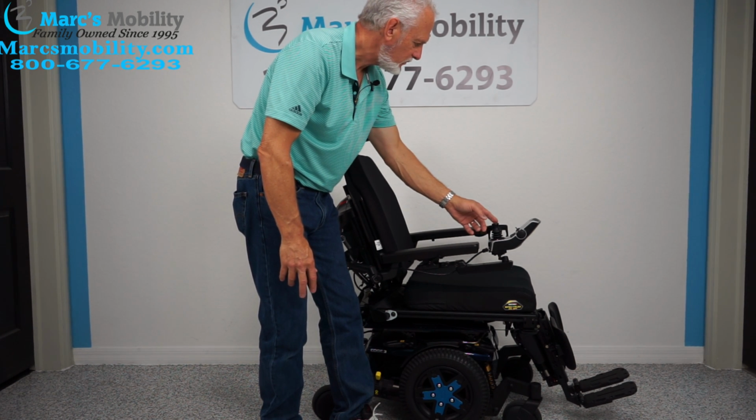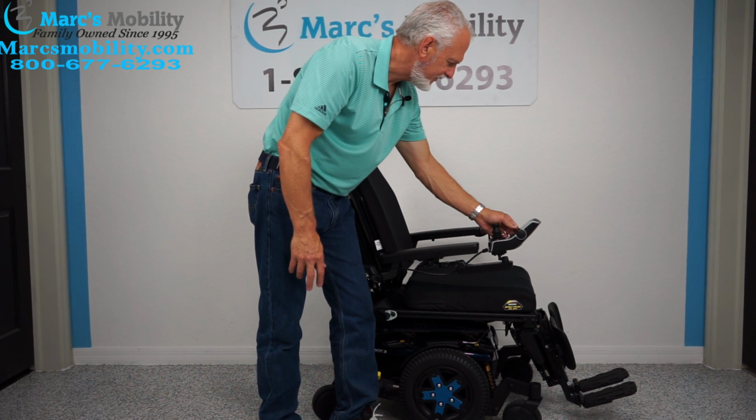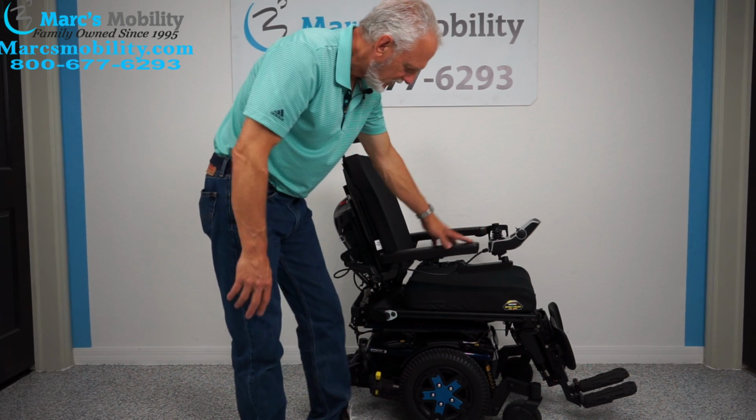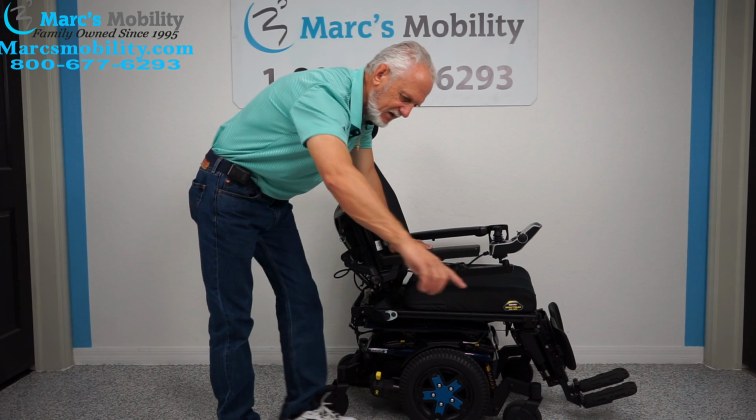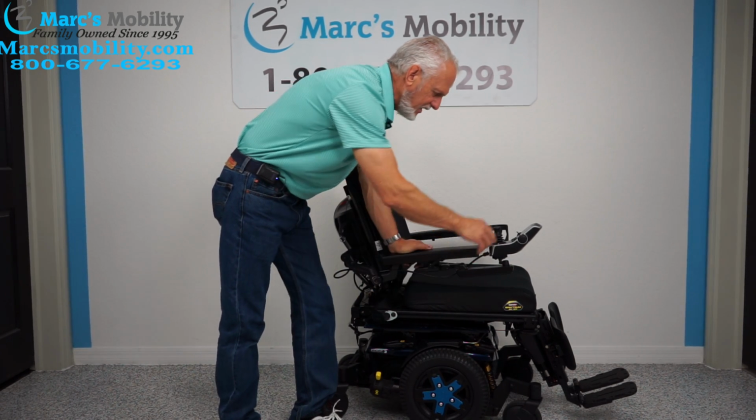So now, we're going to put the chair back in drive. And now this is a mid wheel. So that means your drive wheels are in the middle. So that means it has the best turning radius in your home.